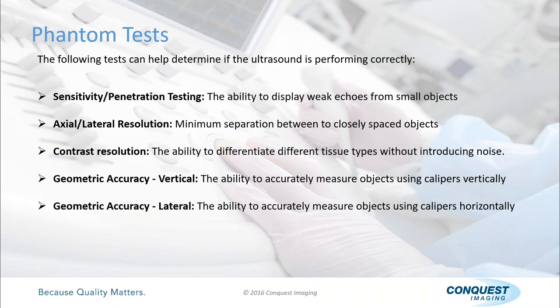So an engineer comes in and says, we need you to test all the frequencies that probe can do. So that would be your general, your penetration, and your resolution. We need to set you up with a single focal zone, only one focal point. They don't want to do a range.